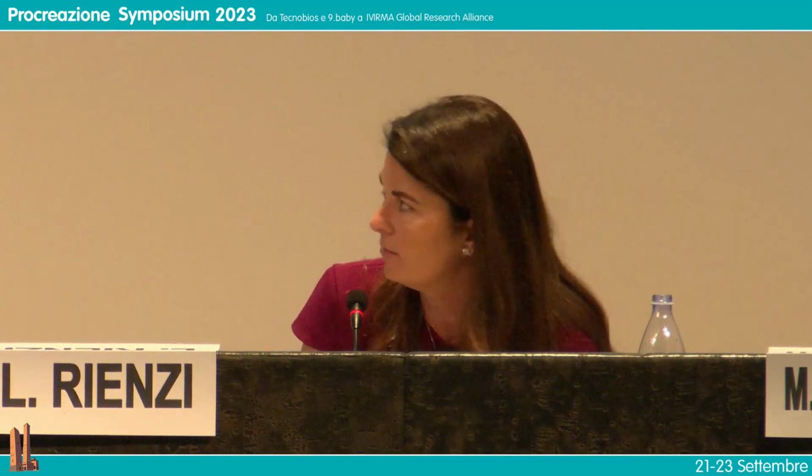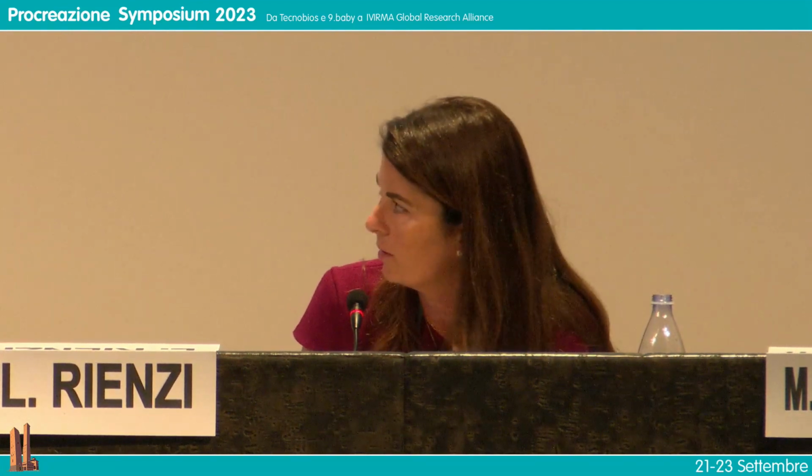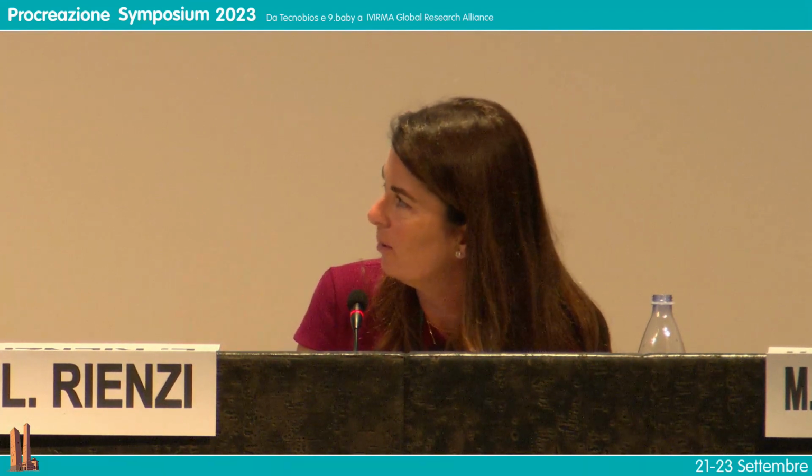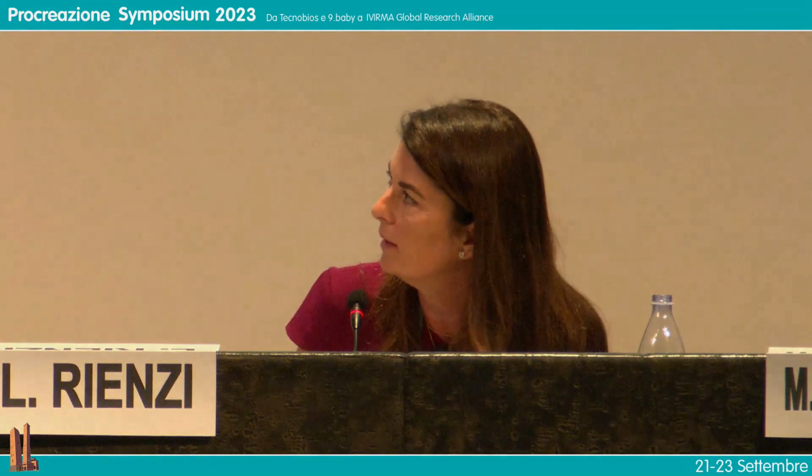I was thinking why we should have seen an improvement, but in fact, when we see randomized controlled trials, undisturbed culture is not really bringing an improvement. So do you think that the fact that with time-lapse we are obliged to use a specific carrier, a specific dish, and a specific volume of media and oil can be a limitation instead of being an upgrade? And in some conditions, a different volume can help more.